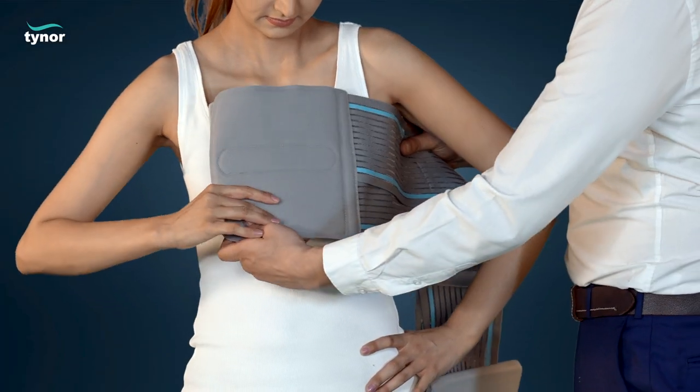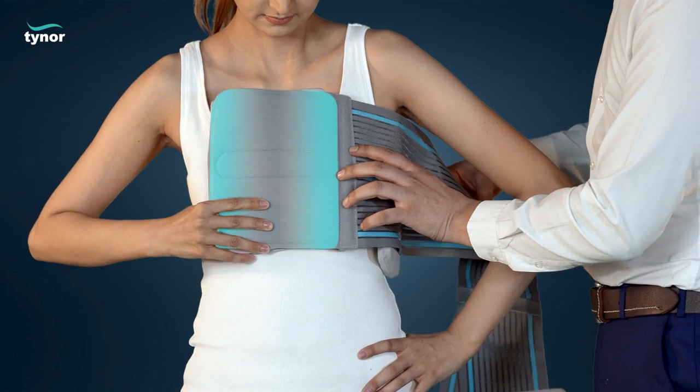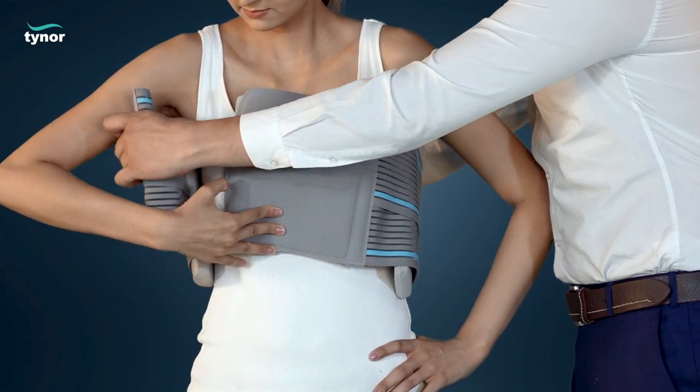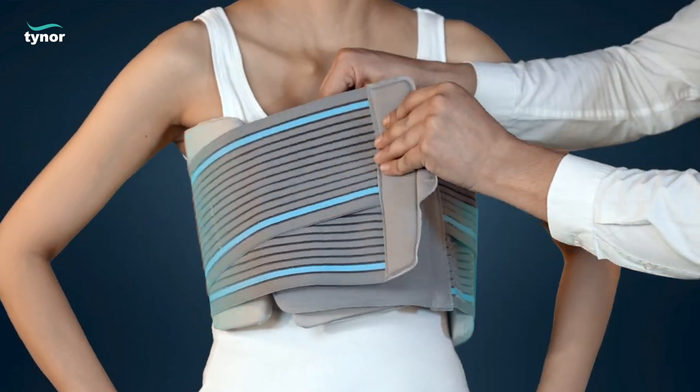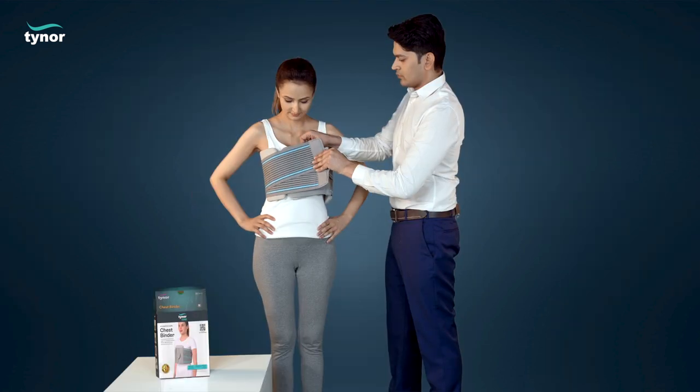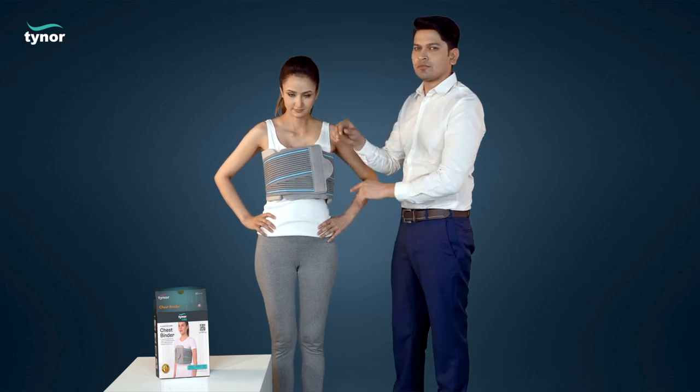Position the larger chest pad in the center of the chest or sternum. The binder is wrapped around the thorax, keeping the other two pads in the right and left anterior axillary line in correct position. Fasten the hook loop closures for optimum compression.